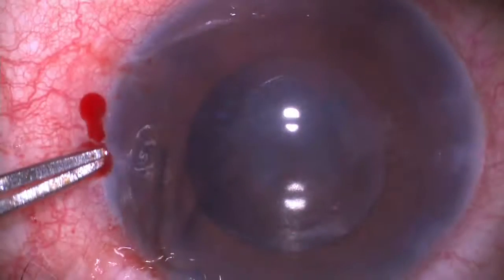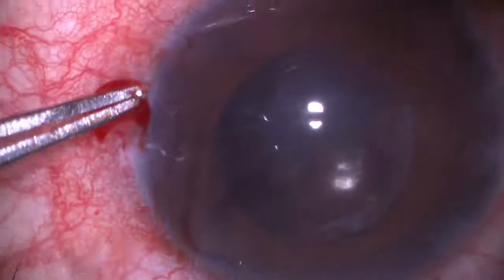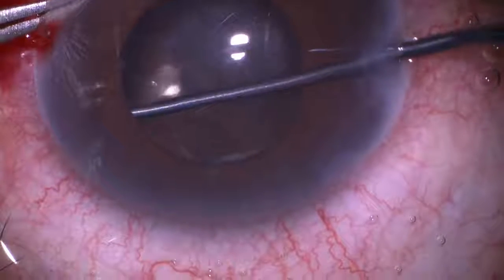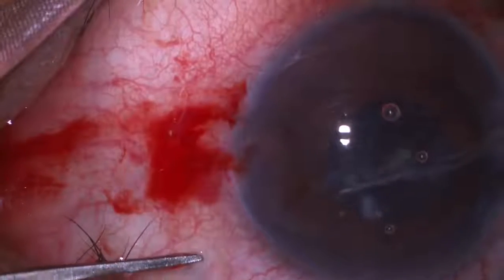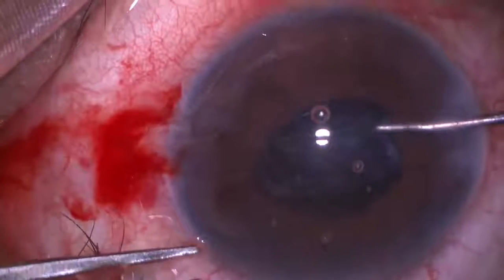In view of persisting symptoms, the diagnosis was revised and replacement of opaque IOL was planned. Due to dense adhesions, separation of IOL from capsular bag was unsuccessful. Haptic was brought in the anterior chamber.